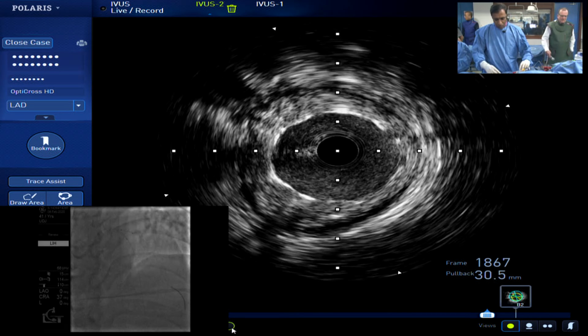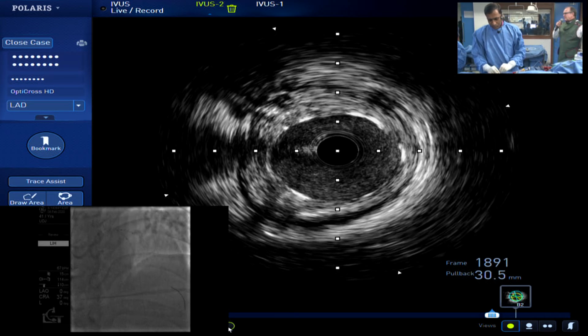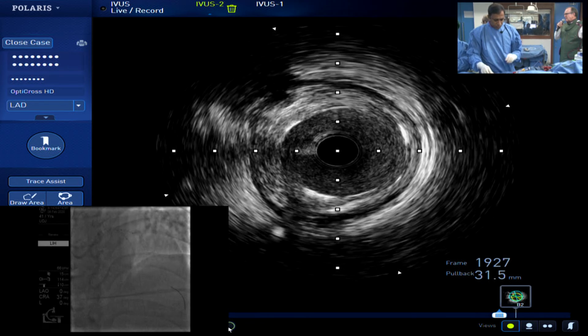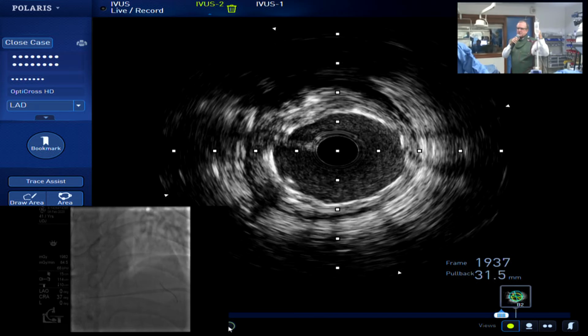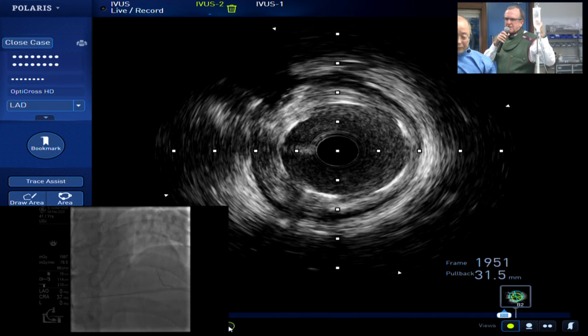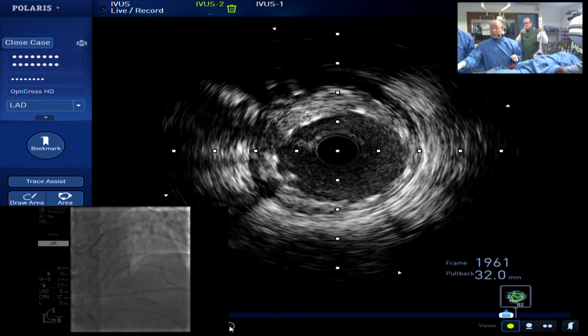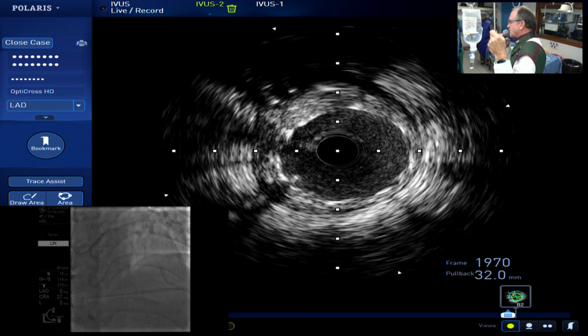Which wire? The guide wire. It seems a very sophisticated analysis and discussion of a problem that I think a lot of us are not faced with, because we don't do a lot of imaging in this situation. I'm curious from the panel, is this a situation that you wrestle with if you're imaging, in terms of the placement of that wire, proximal or distal?